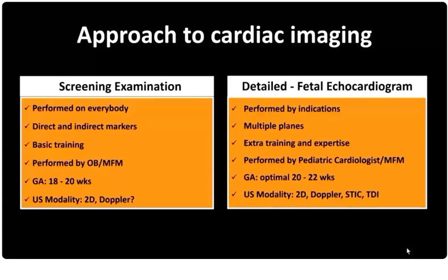If something was detected or suspected during the screening exam, if we have a patient who screened positive, that does not necessarily mean the fetus has a congenital heart anomaly, but that she will benefit from the detailed assessment, which is the fetal echocardiogram. This is an exam performed by indication. We usually assess multiple planes during that exam using different modalities.